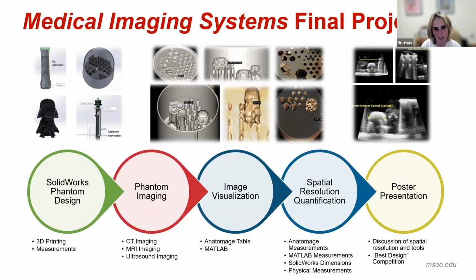But with the CT and MRI images, they then import these images. They come in a DICOM format. They import them into the Anatomage table, and they perform a set of measurements with that. They also compare those measurements to another programming tool that we use called MATLAB, which many of you may be familiar with. In that tool, the students have to do their own programming. So they get to do manual programming to estimate or measure the same object, or small objects within their larger object, and compare that to the Anatomage table measurements.